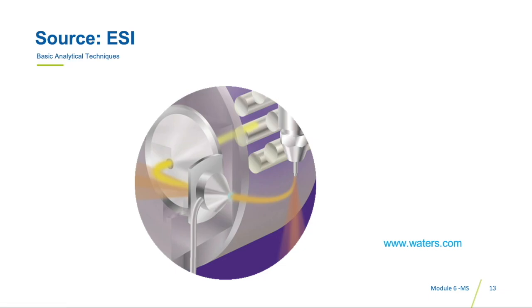This angled design ensures that large droplets that still contain a lot of solvent do not enter the mass analyzer, which can only move gases through the quadrupoles. The wet stream will simply land on the floor of the source. We will look at this source chamber in the practical laboratory portion of this course. At this time, we will start introducing some reasons for failed measurements, or in other words, discuss troubleshooting poor results.